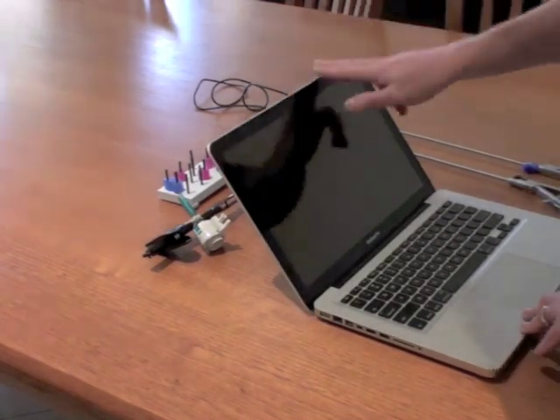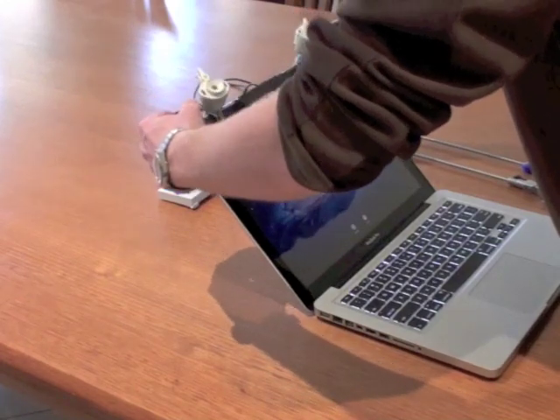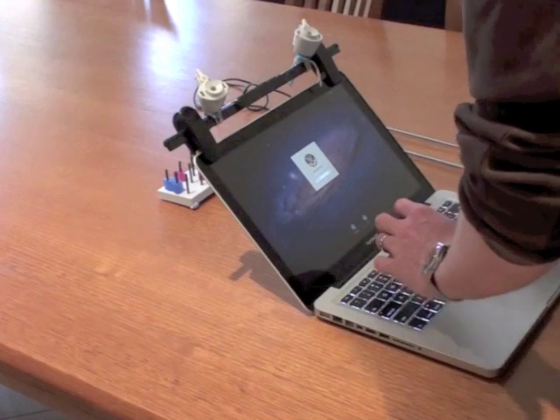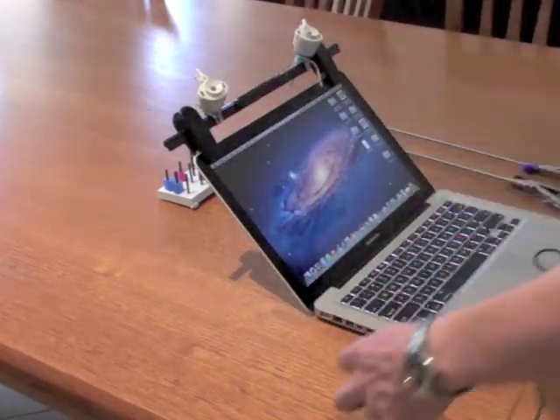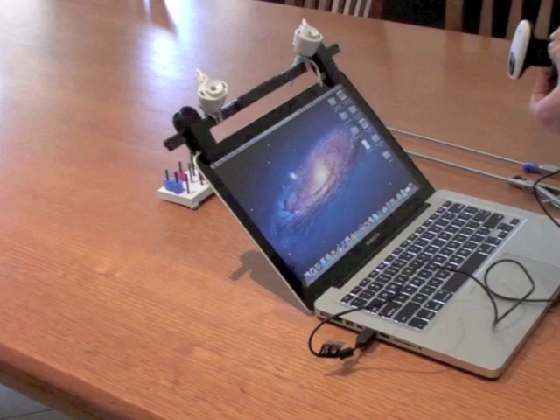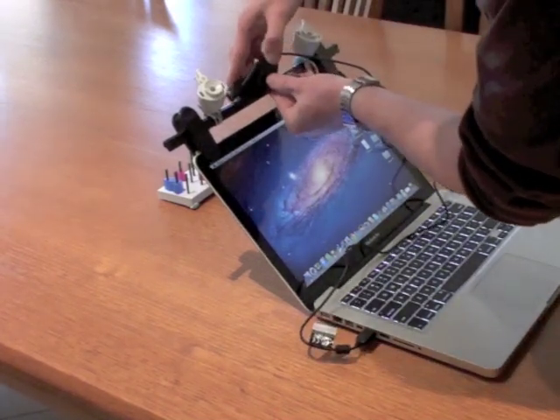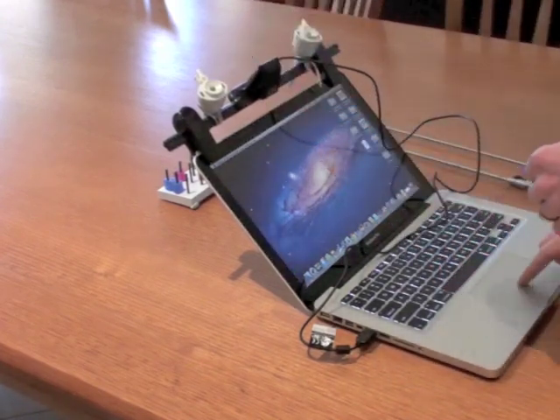Now, to actually use it, just take any old laptop, attach your pre-prepared skirt hanger with the lashed-on trocars to the top of it, and launch a video application. I've used QuickTime here. The webcam just clips onto the top, and you can adjust it later so that it's looking in the direction that you want.